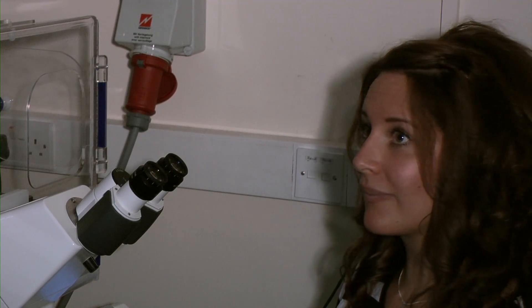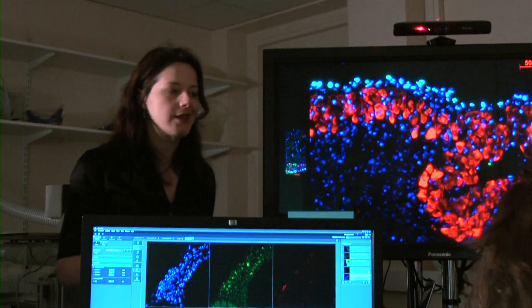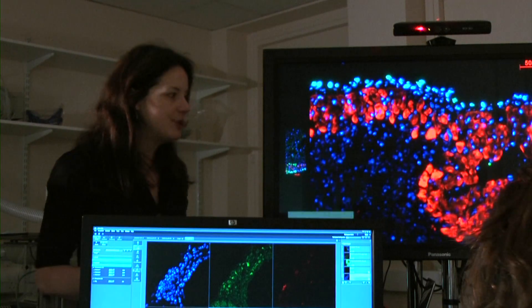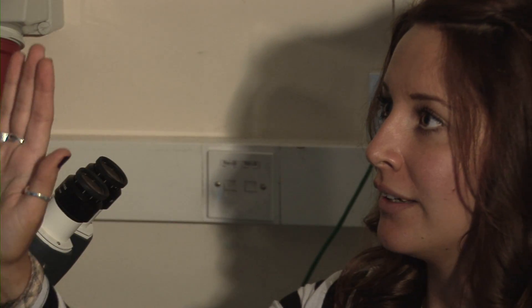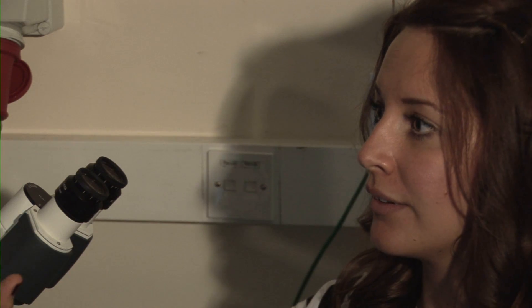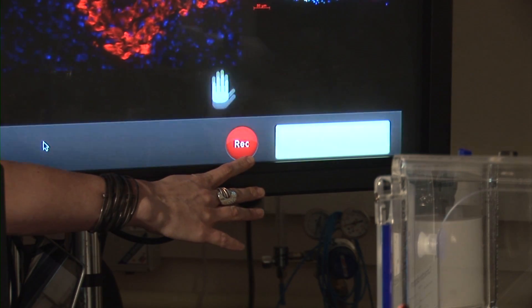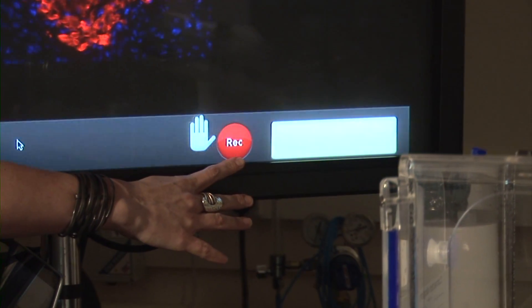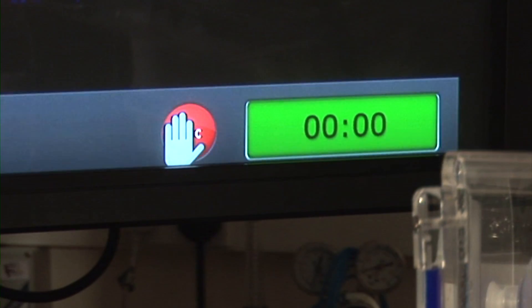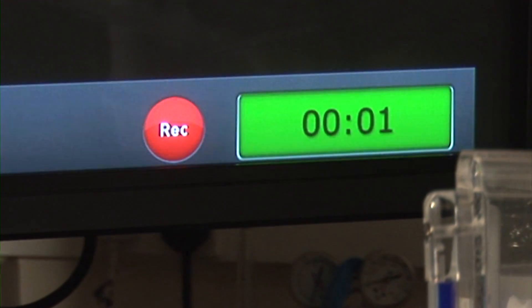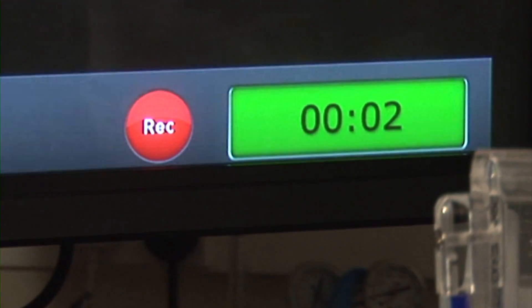One of the things you can also do with this, which I particularly like, is you can record notes while you're looking at the image. Down at the bottom here we have a record function. If you bring the hand down to hover over that, it will activate and start recording, and you can start recording your audio notes.